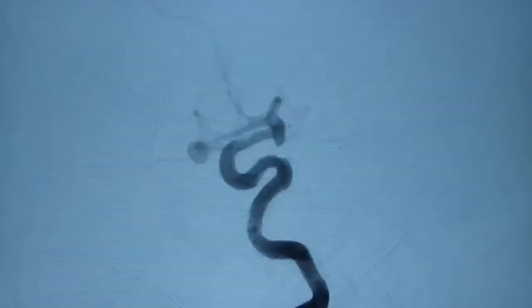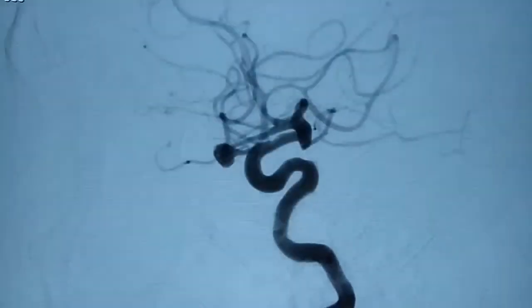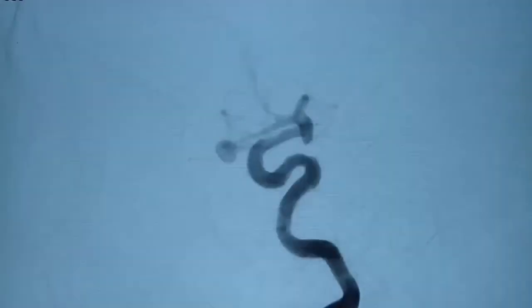We started with an angiogram of the right internal carotid artery, which is demonstrating there is a wide neck aneurysm on the right MCA bifurcation. We will look closely from different angles at the anatomy as well as the different vessels related to the aneurysm, and we will plan for the treatment and execute it.